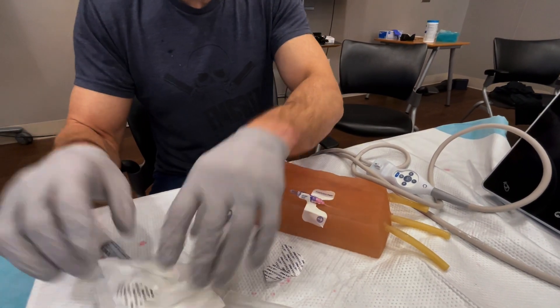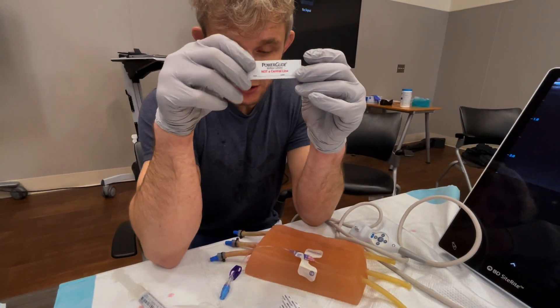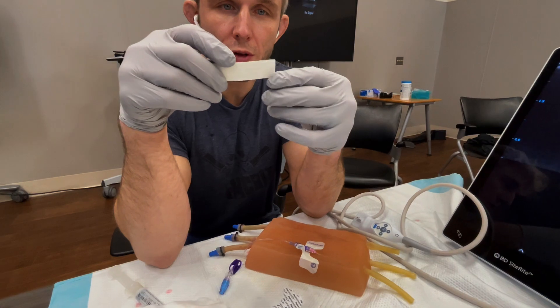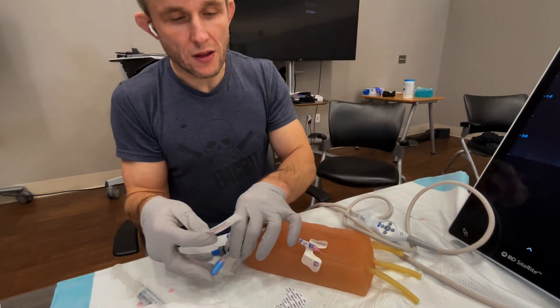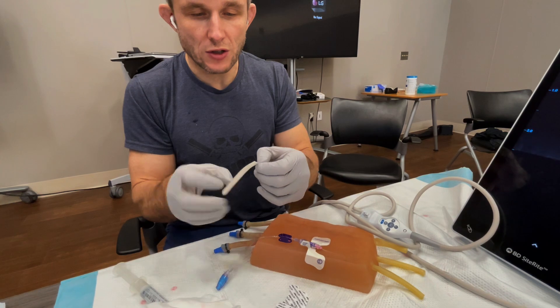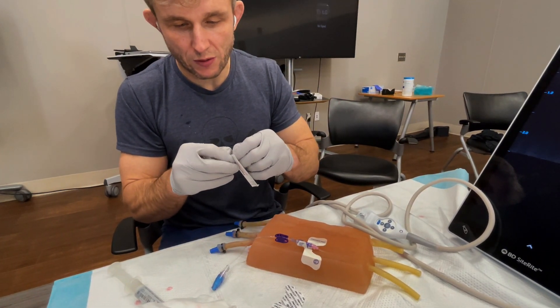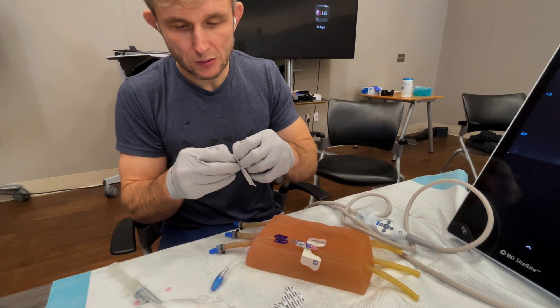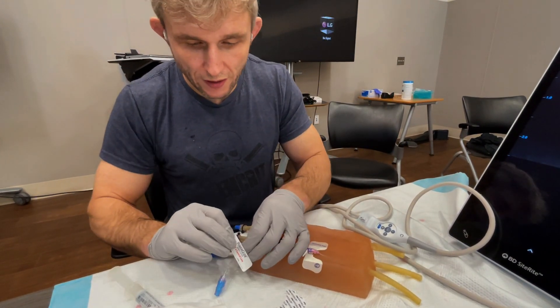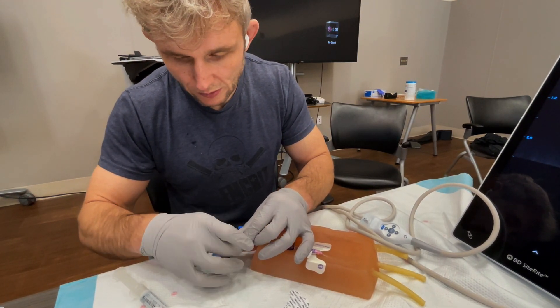The last thing is to make sure you apply this little label that says Power Glide. This indicates that the line is a midline, so when the patient goes to the floor, to the ICU, or wherever they're going, everyone is aware that this is a midline and not a PICC. Peel it off — sometimes it's tricky with gloves on — and secure it to the J-loop.